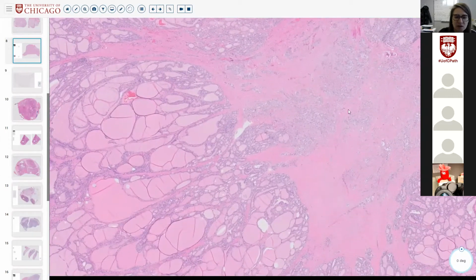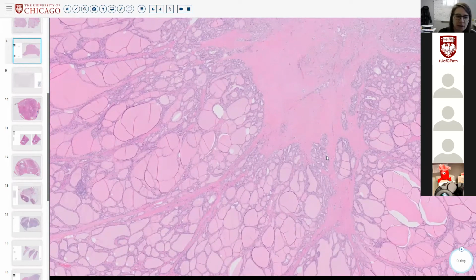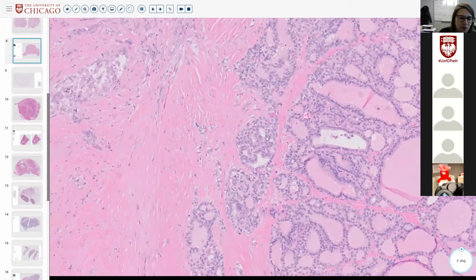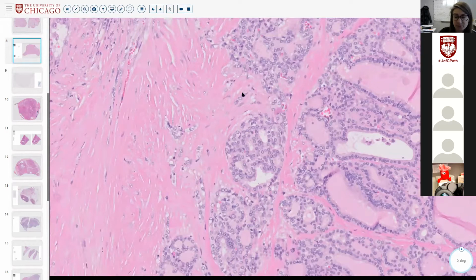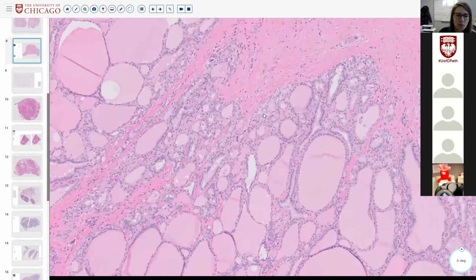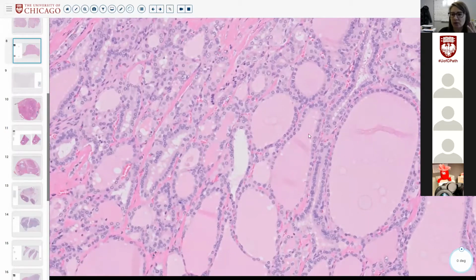If you think it's a scar from a prior procedure, of course, check, but there hasn't been anything here. Also compare to the surrounding. Arguably fibrosis in thyroid can give you some nuclear atypia. So always be cautious around areas of fibrosis to see what kind of nuclear atypia those cells have, whether it's reactive or potentially PTC. Sometimes it's a subtle finding.